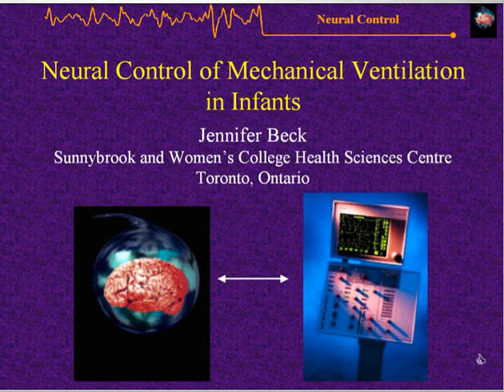Thank you, Mr. Chairman, and thank you to the organizing committee and Siemens for giving me the privilege to speak today about neural control of mechanical ventilation in infants. Neural control is presently an experimental mode of mechanical ventilation. It uses the electrical activity of the diaphragm to control both the timing and the level of the assist provided to the patient. It has the same goals as conventional mechanical ventilation, but it has the added aim of trying to overcome the problems that are associated with patient ventilator asynchrony.